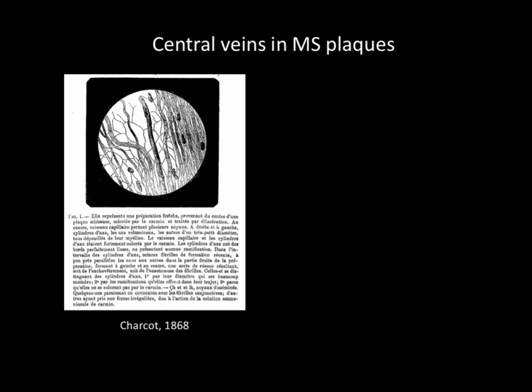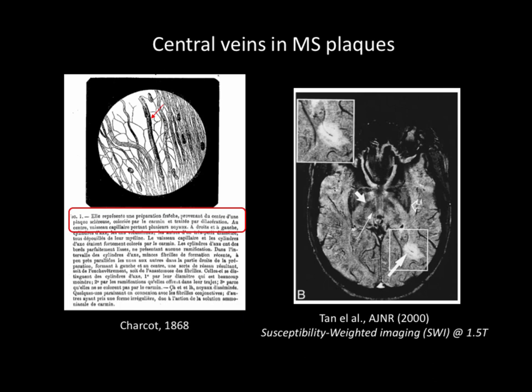And looking under the microscope at his tissue, he started drawing those cartoons, and he pointed out, if you can read French, which fortunately I can here, I can translate for you guys, it's basically telling that there is actually a small vessel at the center of the plaque of the lesion. And this has actually been known for quite a while, and only recently has been revisited by MR.